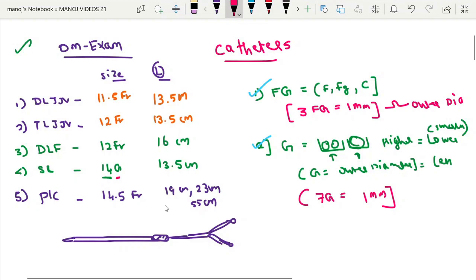Usually this is the tip to cuff. For example if it is 19 cm catheter, it will be 19 cm. And from the cuff to this outer hub, it is usually 17 cm for all the 3 catheters. So this is the summary.